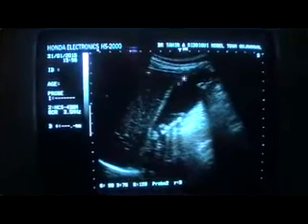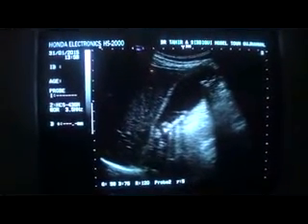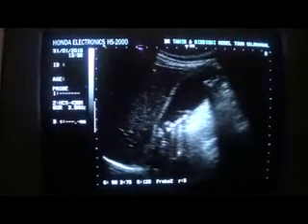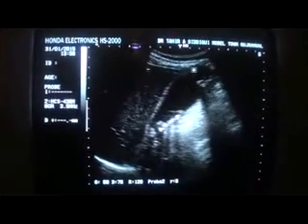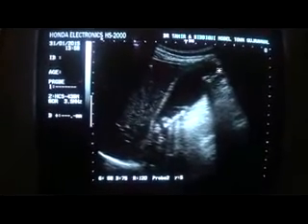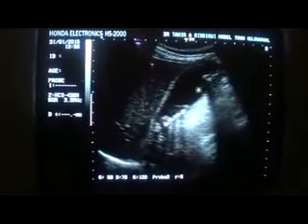So the wall is not thick, and this is the liver around the right hemidiaphragm, and these tiny areas giving sharp posterior shadow are the calculi layered out with the posterior wall. Now note another interesting thing. Always see the fundus of the gallbladder, because you may miss calculi in this area.